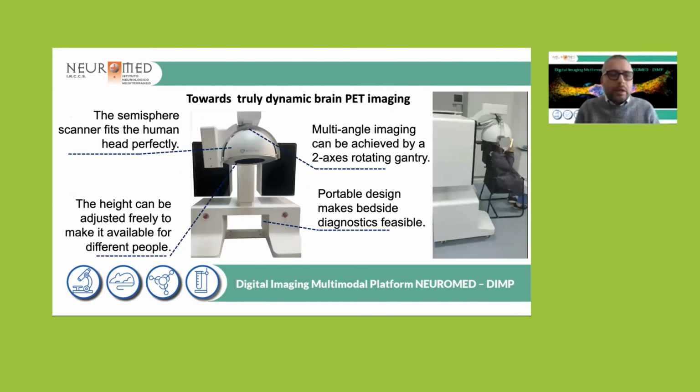So how do we go forward? The point of this talk, of this seminar today, is also to show a bit more perspective. How can we have a technology which is truly dynamic for the brain? And here is the future, or what is happening right now, a completely new device: a helmet-shaped PET system, which can follow the patient. It can go up and down.